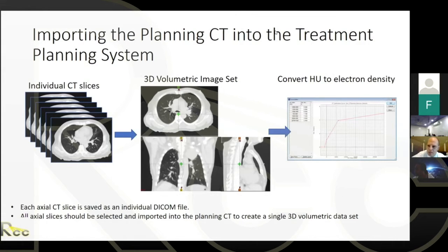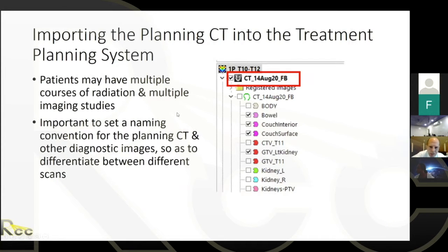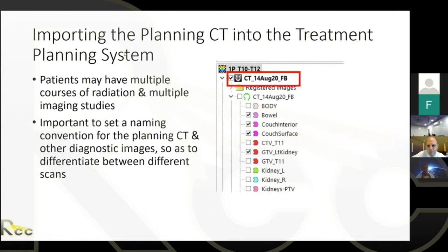Yeah, so the way this usually works, planning software automatically recognizes tissue density. Let me just go, here we go. Let's just talk about it here. I will answer this question in the next 3 slides, and let's move a little bit forward and then we'll answer that. But I'm just going to do this slide real fast as well.